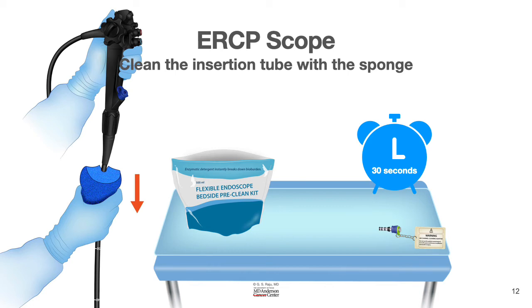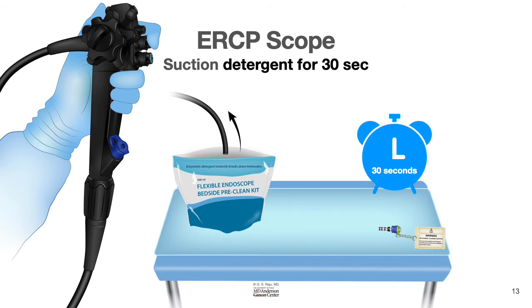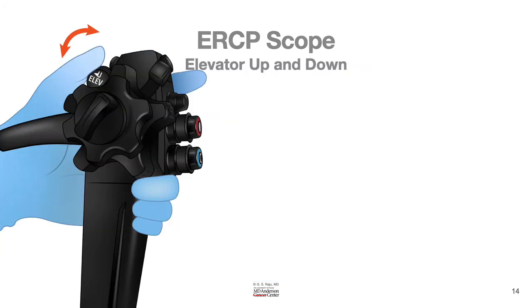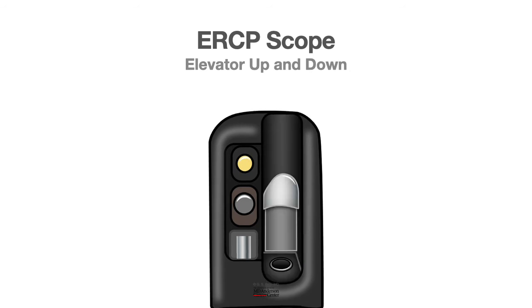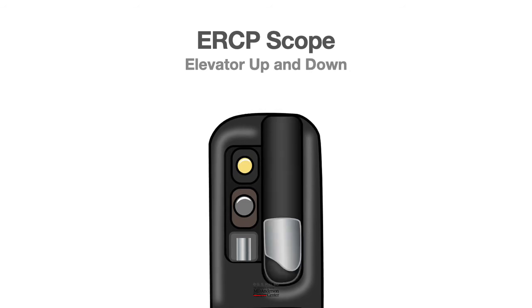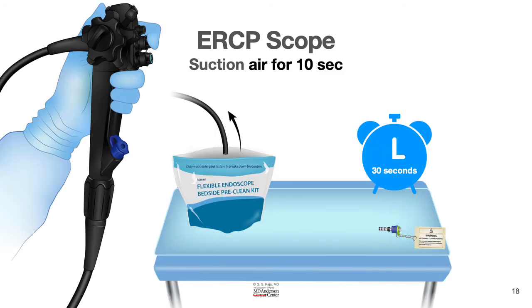So when it comes to the suction channel, you place the endoscope into that detergent and suction the detergent for 30 seconds. And during this process, it is important to move the elevator up and down so that as you're suctioning the detergent, as you move the elevator up and down, it will get rid of any proteinaceous material under the elevator. So it's very important to do this. And once you completed the suction of the detergent for 30 seconds, next you remove the scope and suction air for 10 seconds. This completes the cleaning of the suction channel.